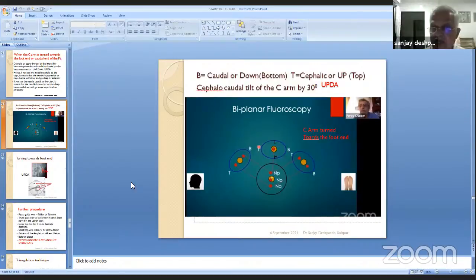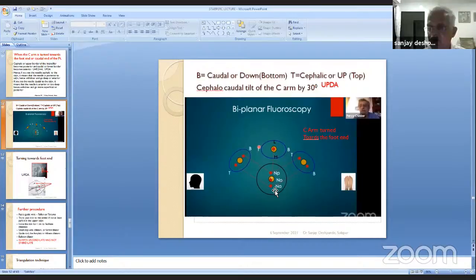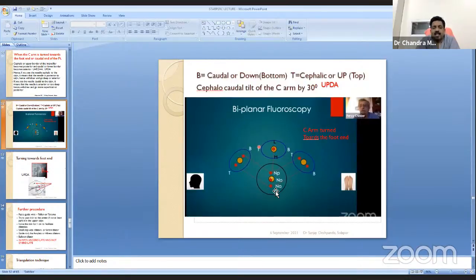By and large, it is a bit like hybrid. Because if you use bullseye, you are more likely to puncture the pleura. It will be more medial and more superior. That is the problem. So in bullseye, upper pole, it will be medial and superior. So there is more chance of injuring the pleura. That's why you have to make a certain angle.